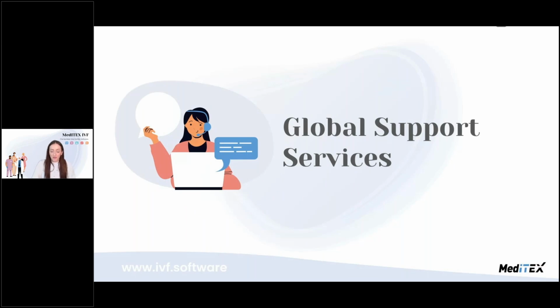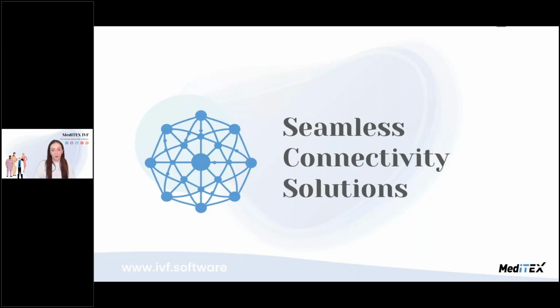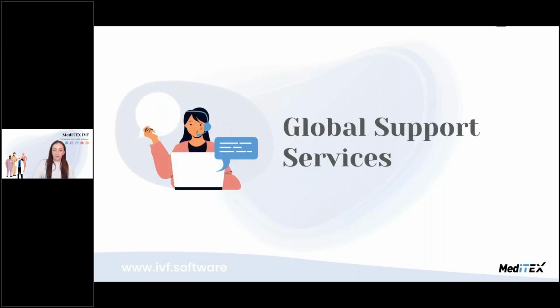The global support service: we saw earlier in the beginning of my presentation that we visit our customers. For us, it's really important to not only sell the system, but also to walk hand in hand with our clients from the very beginning, supporting through configuration, performing efficient training, the entire transition phase. We also have a strong partnership with different distributors all over the globe, which allows us to be present and to support our clients before the implementation, during the implementation, and of course afterwards.